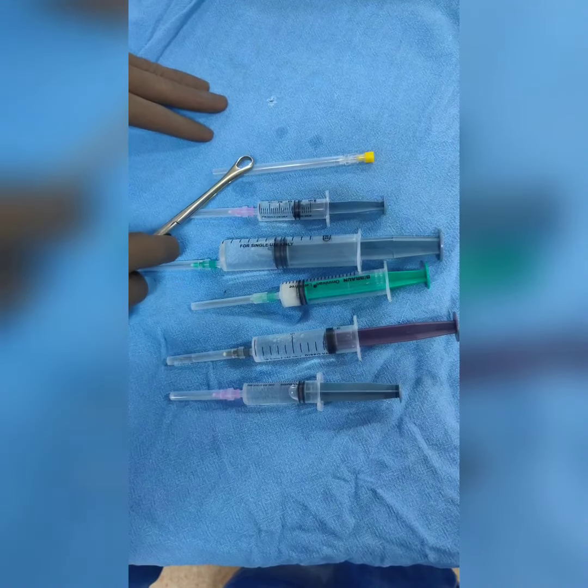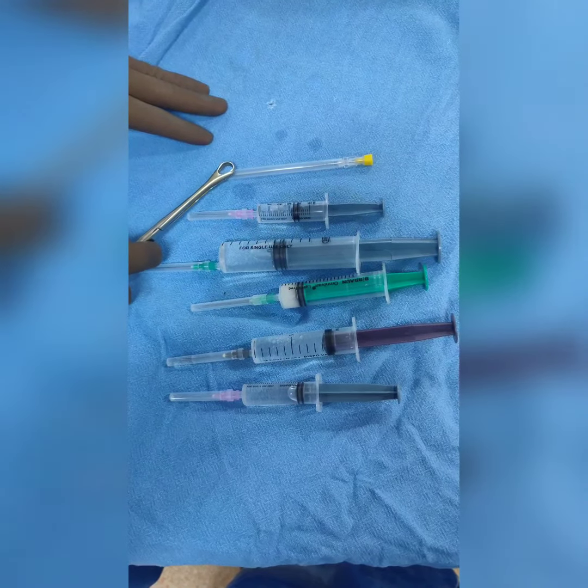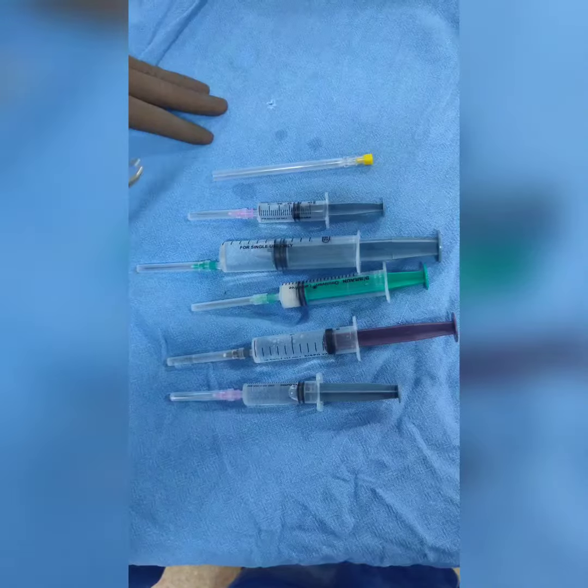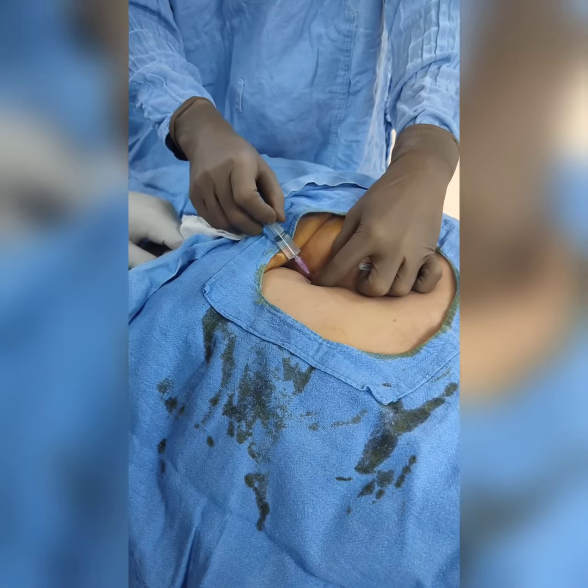This is another syringe with lignocaine for regional anesthesia. This is the spinal needle for injecting caudal epidural.